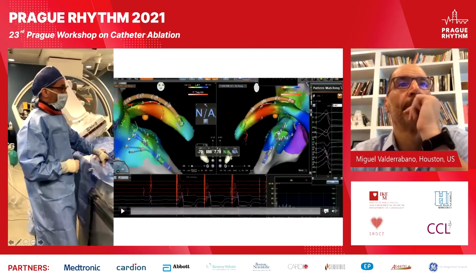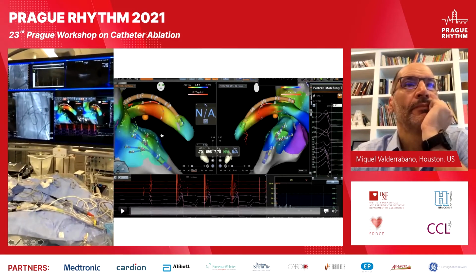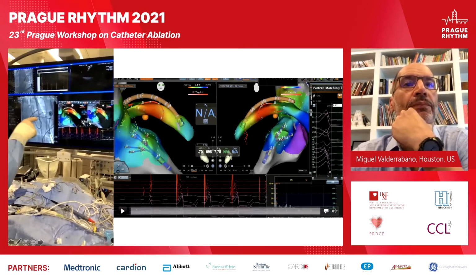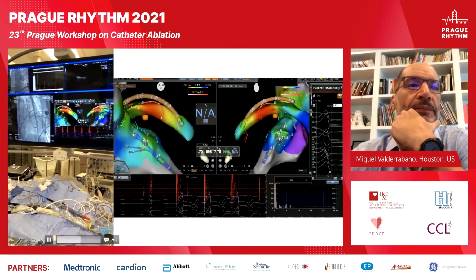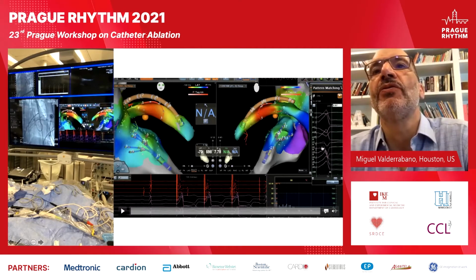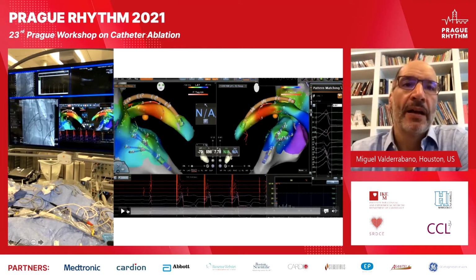So we have engaged the AIV with a small catheter, a 2 French octopolar catheter, and we found the distal end is engaged in what we think is a septal branch. Pacing from the distal octopolar there, we get a 97% match. Real-time analysis, so it was a 97% match, as you can see here by the Carto PASO software. But if you look carefully at V2, there's an R wave in the natural PVCs, and we don't have an R wave in the paced beats. And the activation time there was not perfect.